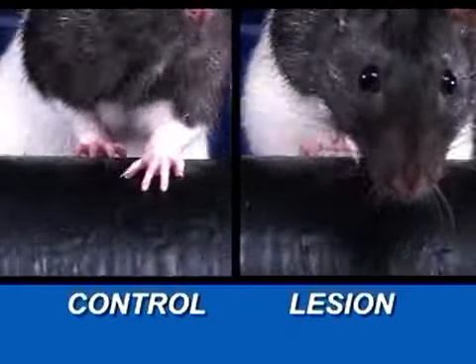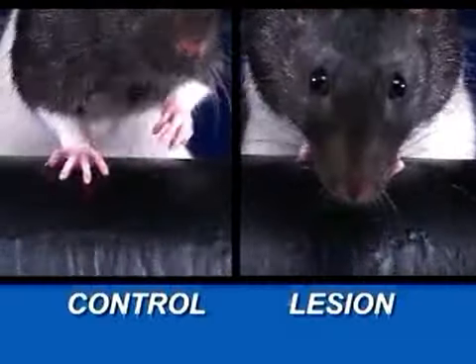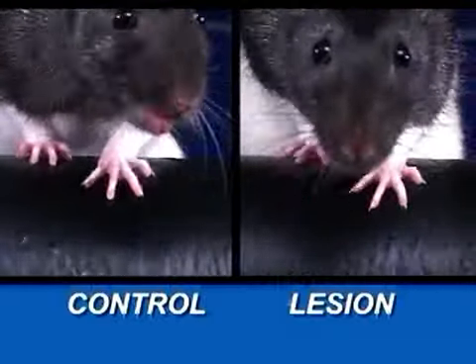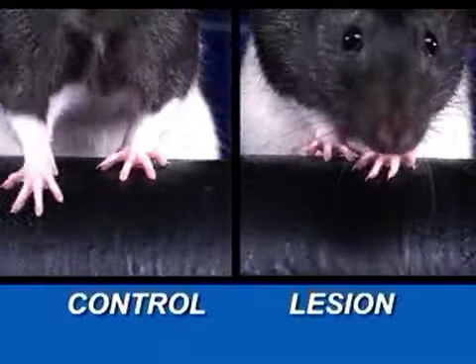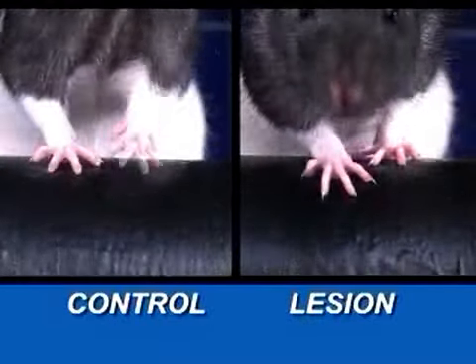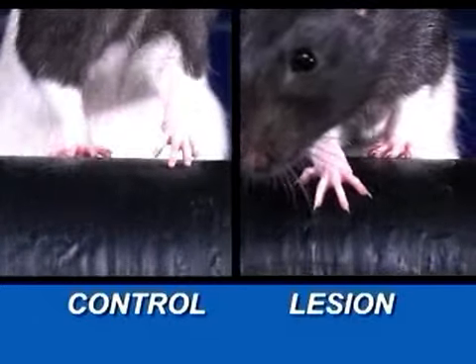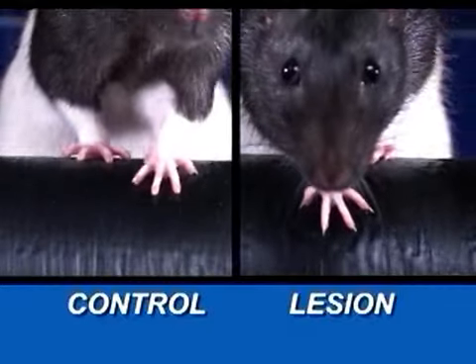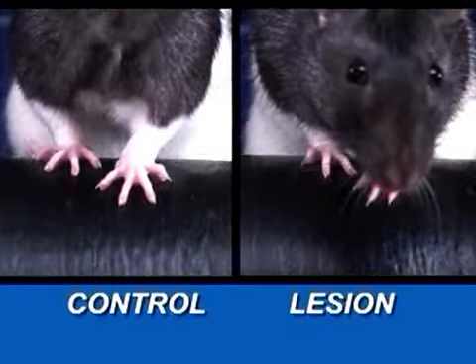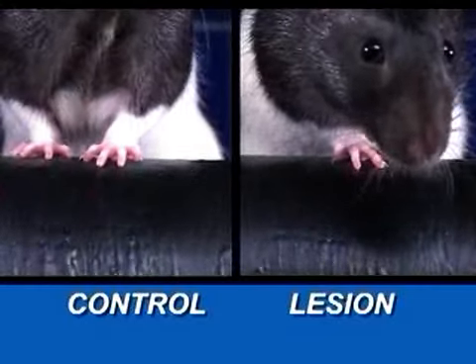The control animal's weight-bearing paw releases from the rotorod quickly and is carried high so the digits are well clear of the drum surface. Its digits spread wide and contact the rotorod in an arpeggio movement from digit 5 through 1. The 6-OHDA animal rides the paw contralateral to the lesion longer before release and advances it more slowly. Note it carries the paw low, with the digits often dragging on the drum surface, which compromises the placement.